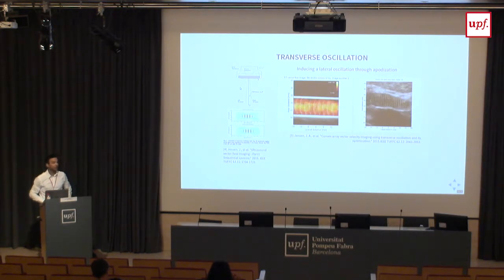Very similar to what we heard before, in ultrasound, if you're in the far field, so basically for our interests, anywhere in your image domain a few centimeters from the surface, the point spread function that you will get is the Fourier transform of your apodization function. So if your apodization looks like this, like two peaks, more or less, then your Fourier transform will be a sinus, so it will be a sinusoidal oscillation laterally. And then the bigger your aperture, the higher frequency this can have.